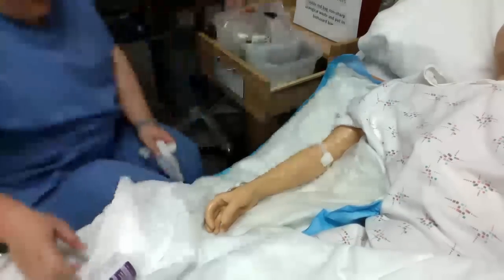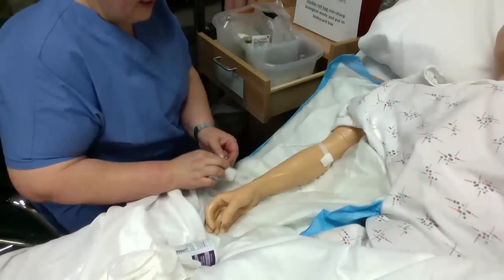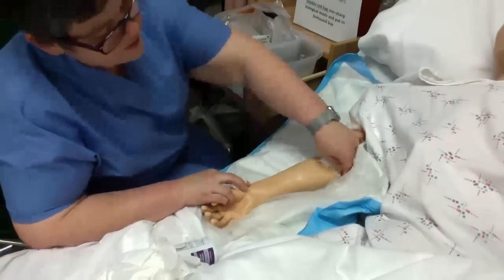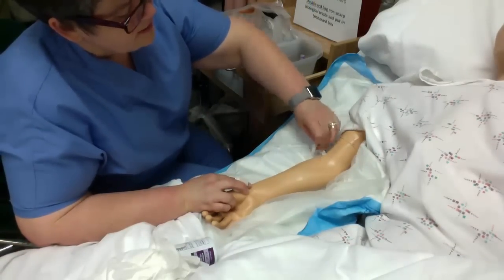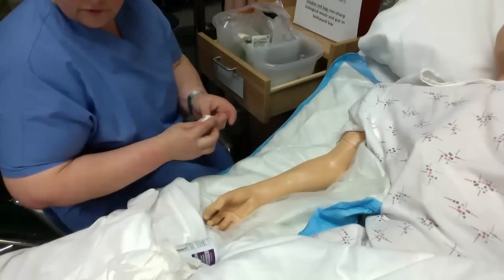I have shown you an example of getting a venipuncture from a client. I started out with AIDET. Didn't quite repeat that when I came back. And then before you leave your client, you want to do your four P's.